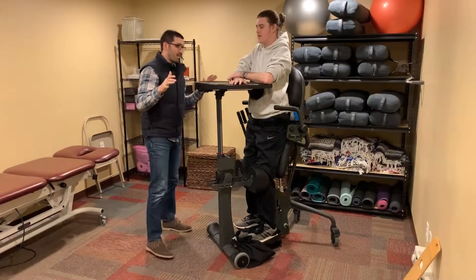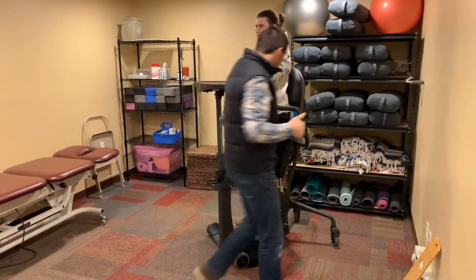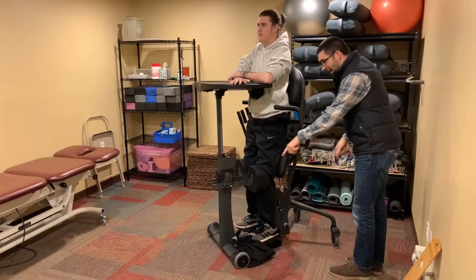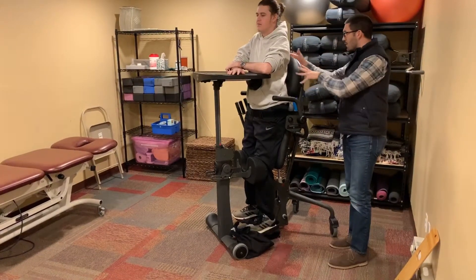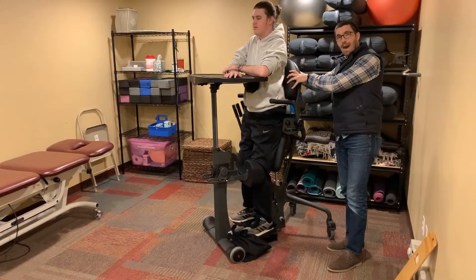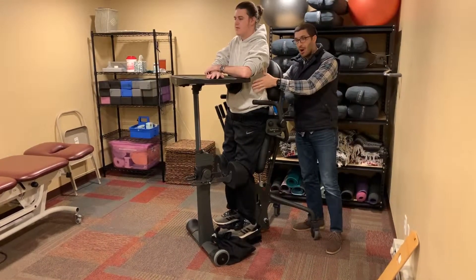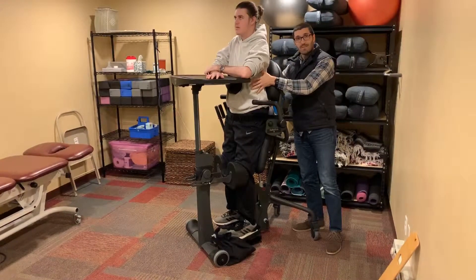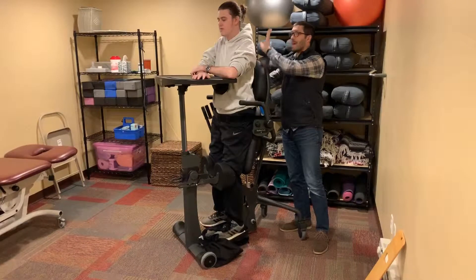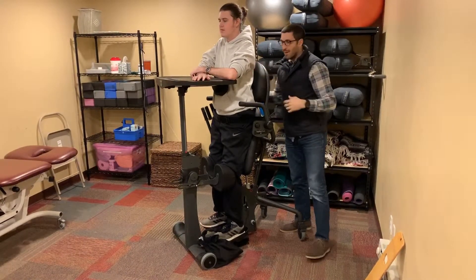You can do anything on this device from front and back casters, you can change out the type of backrest that you have, you can get laterals on it to provide some trunk stability, you can do a headrest off of this, you can do a chest strap.